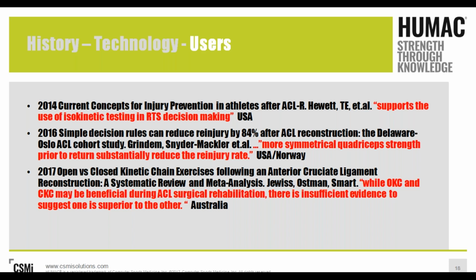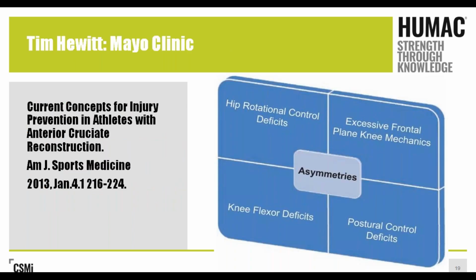So in our first course, when we talked about history, I also mentioned Tim Hewett, who's out of the Mayo Clinic. Fantastic researcher, biomechanics specialist, runs a great biomechanics lab at the Mayo Clinic. And we talked about supporting the use of isokinetic testing in return to sports decision making.